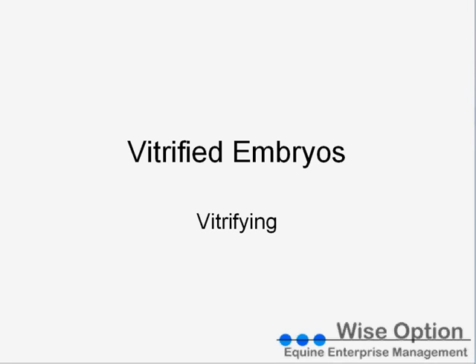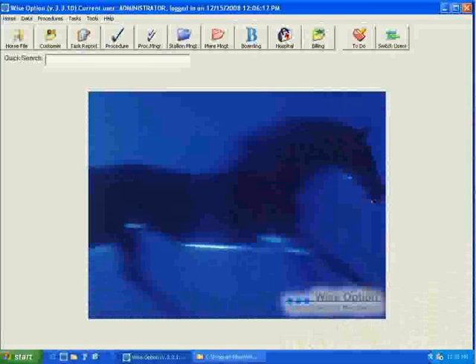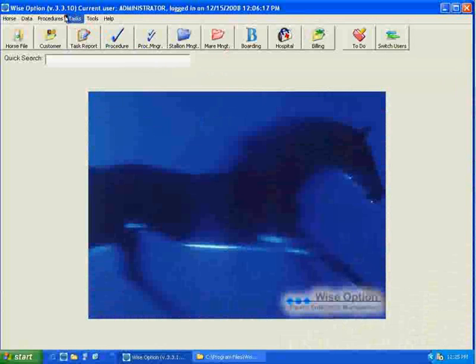In this e-learning, we're going to show you how to use the vitrified embryos module in WiseOption in regards to making a new entry for a vitrified embryo. Let's go to the program, and the first thing you need to know is that this vitrified module is available from version 3.3.10 on, and you also must have the frozen module available for your WiseOption.